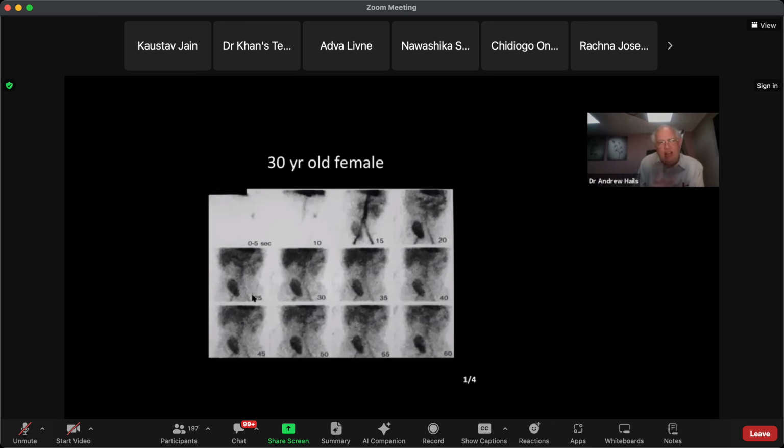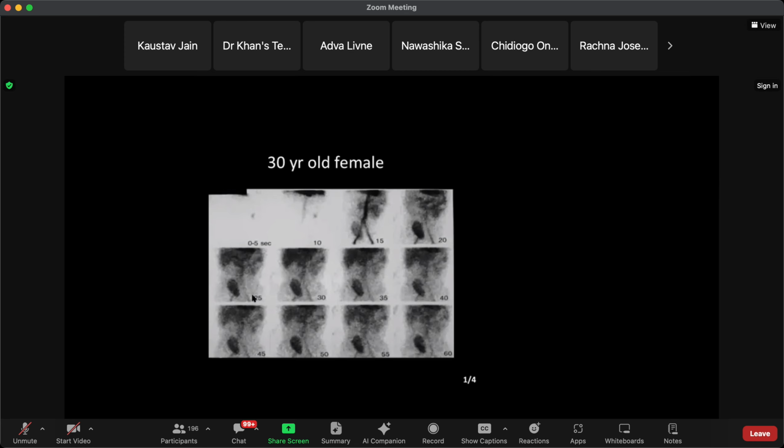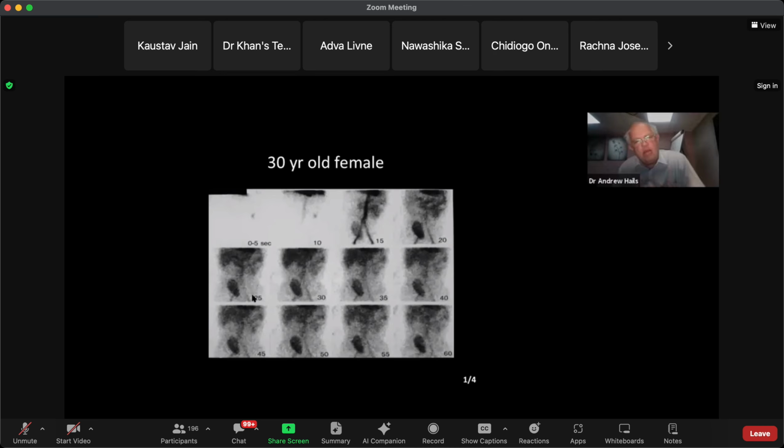So basically, if you're thinking transplant, it goes in the front of the patient. So unlike normally with a MAG3, where you put the camera behind them, I'm sorry about this, I've purposely misled you: for the transplant, you put the camera in front. So that would be the right kidney.